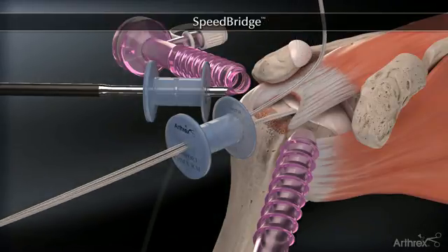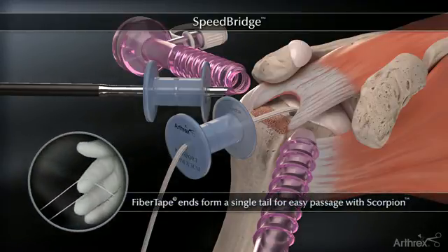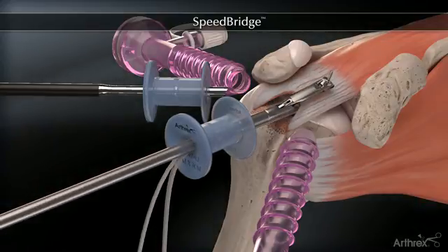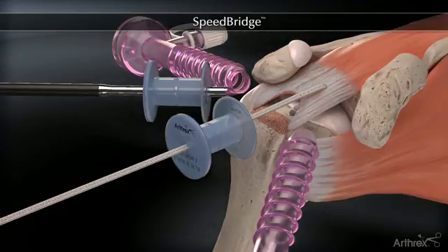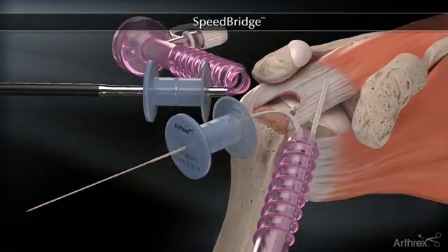The fiber tape is retrieved laterally. The fiber tape limbs are joined into a single tail to allow easy passage with a fast pass scorpion, which automatically retrieves the passed suture. The fiber tapes are moved to an accessory portal and the process is repeated for the second medial anchor.